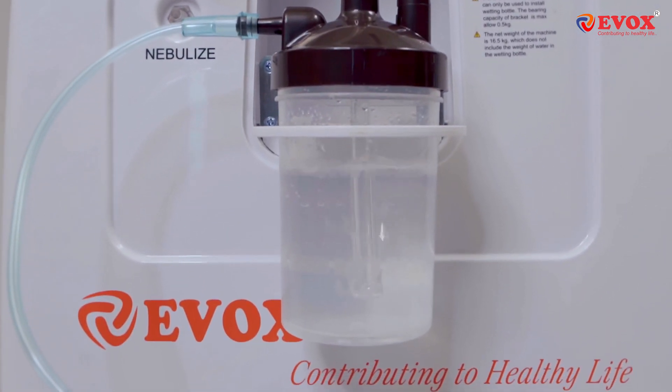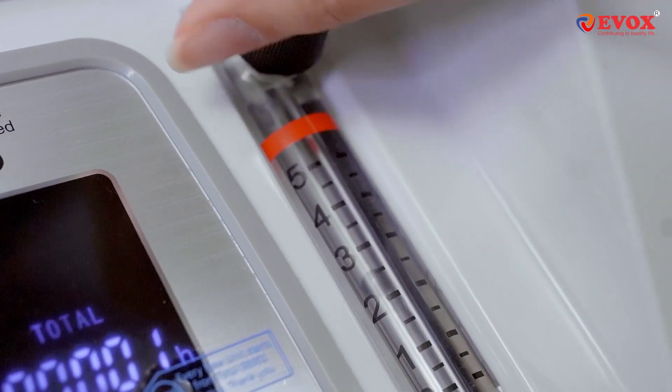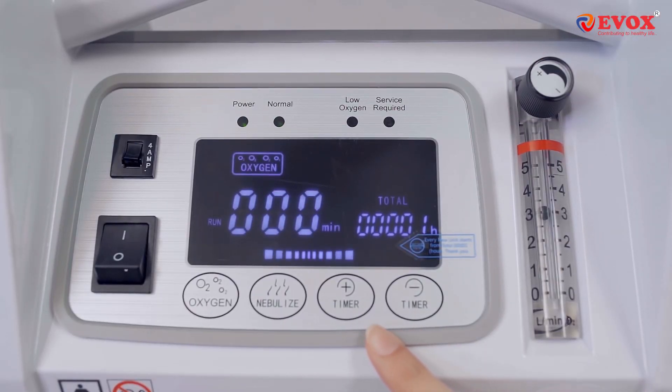While the oxygen concentrator operates, you can manage the oxygen flow meter and set it as per the prescribed oxygen level. Once that is done, also fix the timer using the timer button.